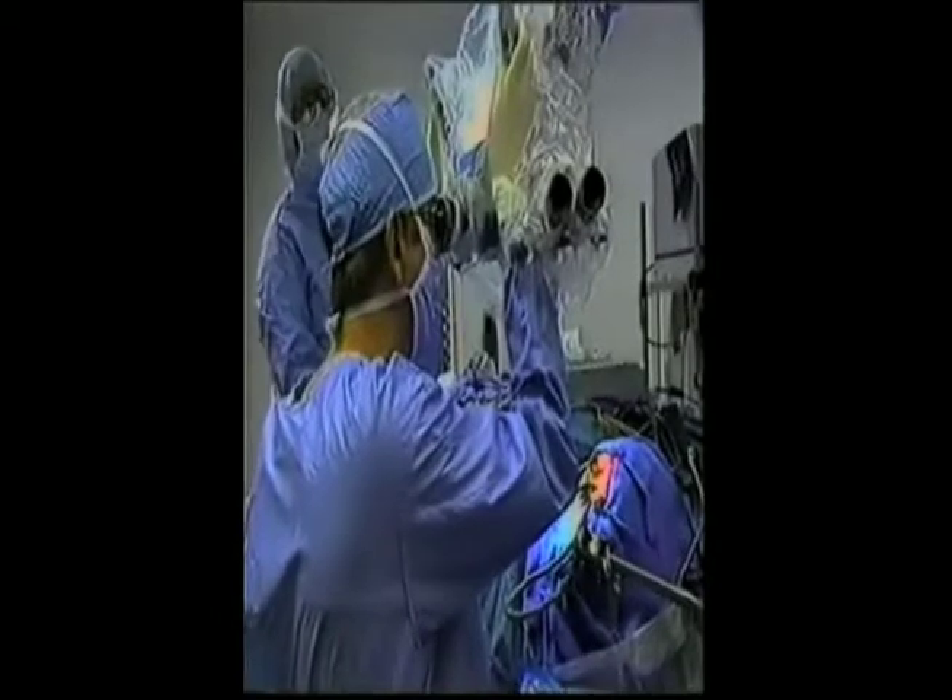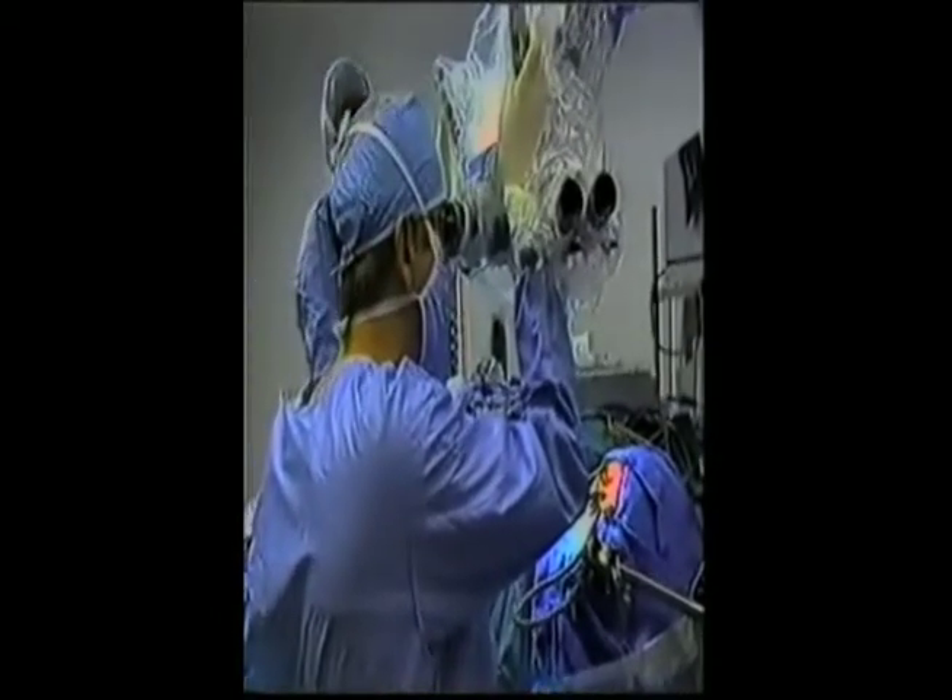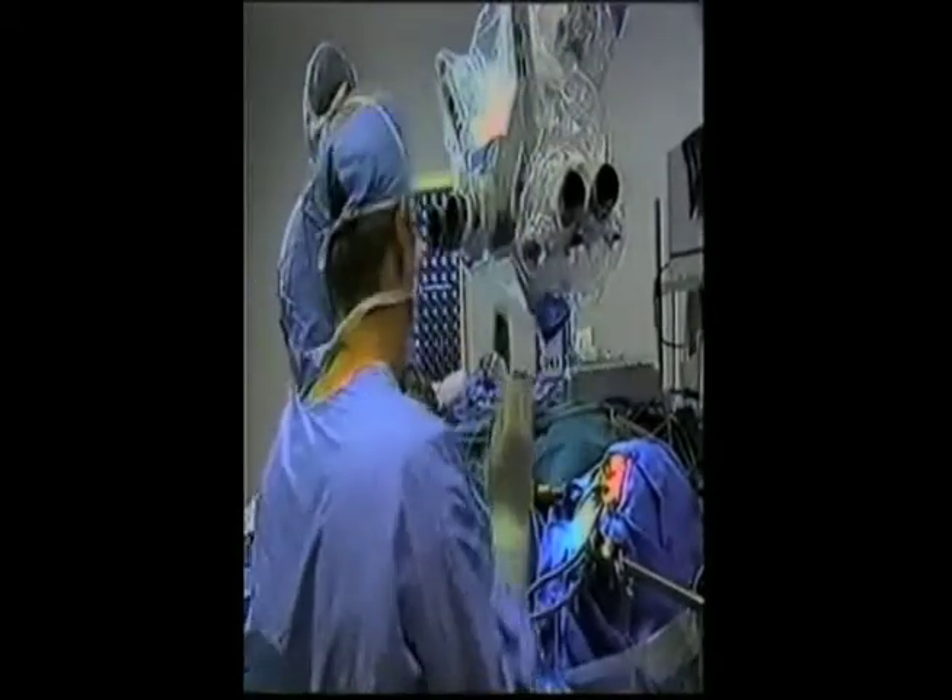Molar Microsurgical, a name synonymous with the highest quality surgical operating microscopes for delicate neurosurgery, ophthalmics, and ENT, is proud to bring its trusted technology and reputation for excellence to the dental surgeon.